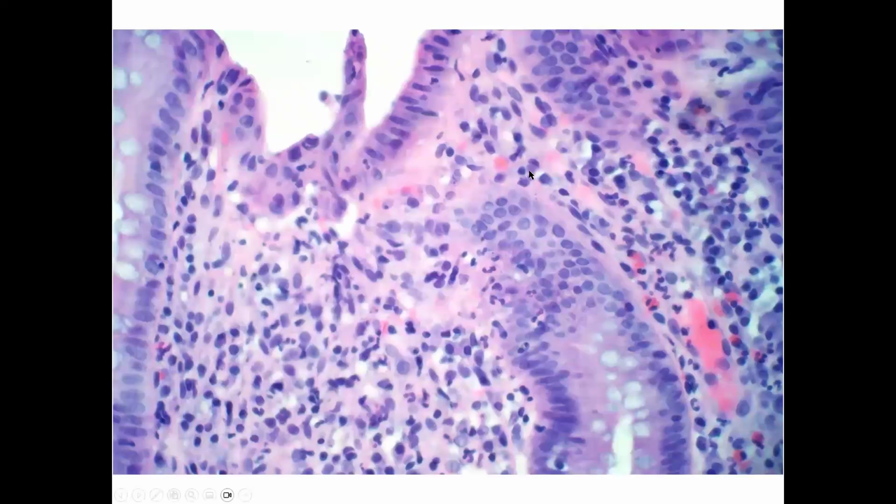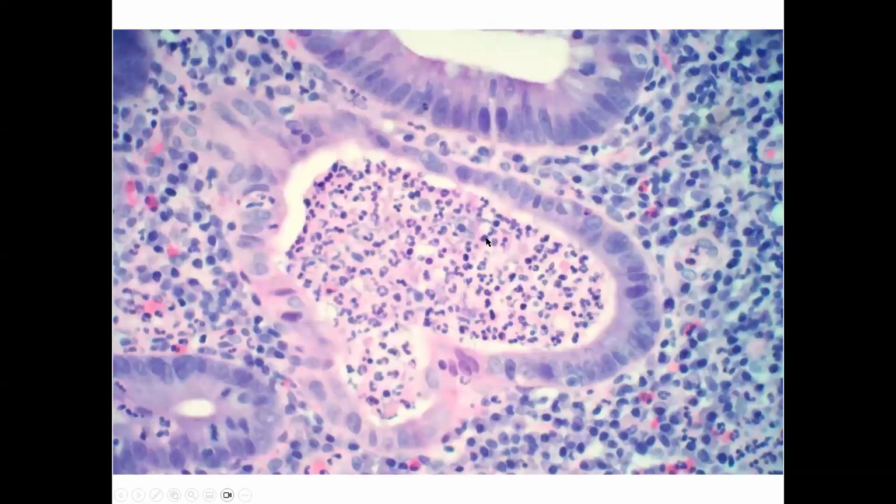Here's an example of colon, which I've zoomed in on, where we can see a different type of inflammatory cell within the epithelium. In this case, these are neutrophils. This is similar to what we saw in the active gastritis in the H. pylori case. So we have neutrophils present within the epithelium. That's called cryptitis when it's present within the epithelium.